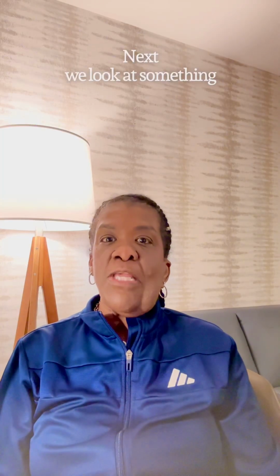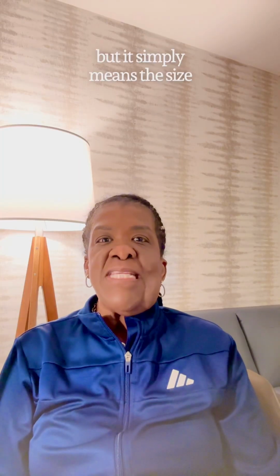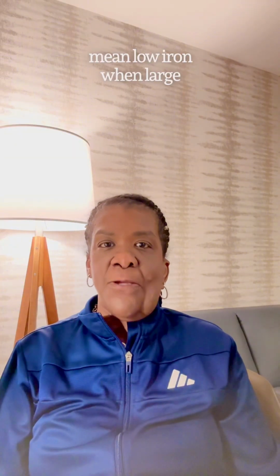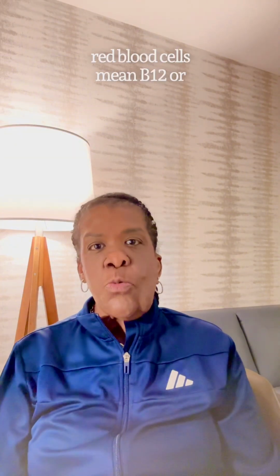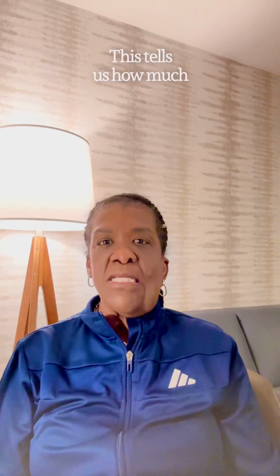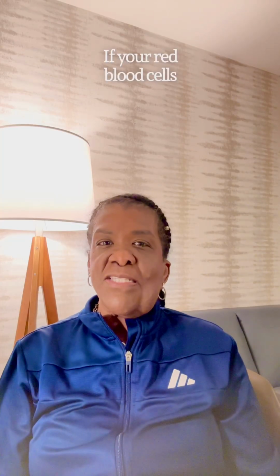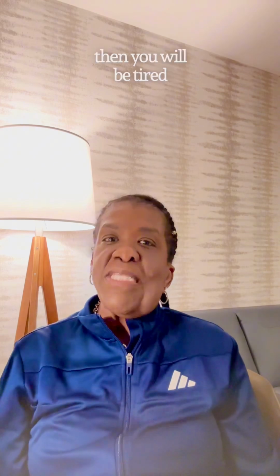Next, we look at something called MCV, mean corpuscular volume. This is a big name, but it simply means the size of your red blood cells. Small red blood cells often mean low iron, while large red blood cells mean B12 or folate deficiencies. Next is MCH, mean corpuscular hemoglobin. This tells us how much hemoglobin is inside of each red blood cell. If the MCH is low, the red blood cells may carry less oxygen. If your red blood cells carry less hemoglobin, then you will be tired.